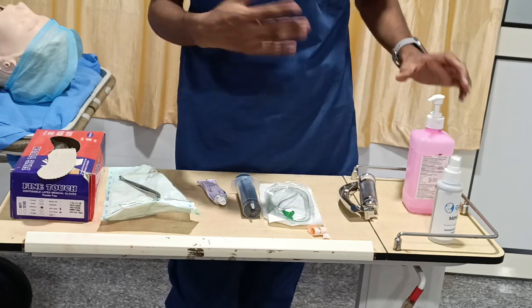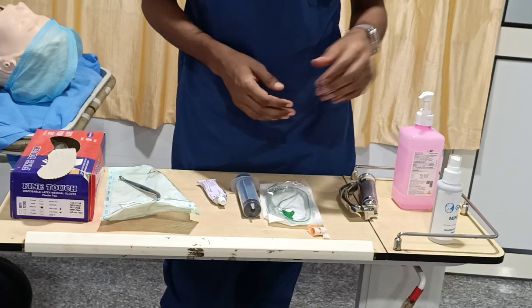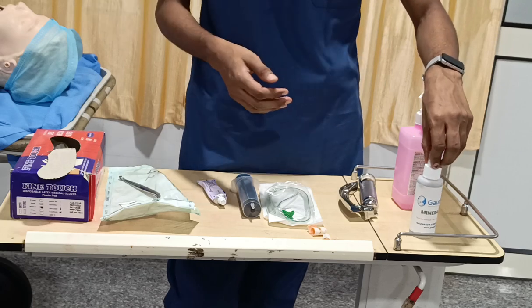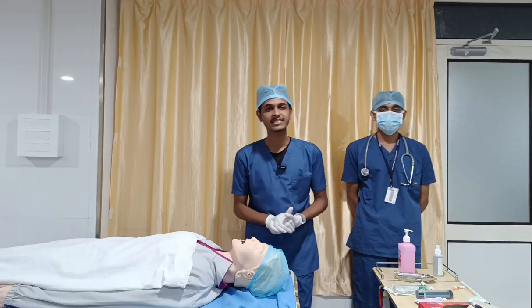So these are the common things. Don't forget to perform your hand hygiene; you have to keep your hand rub also. We are going to perform this on the mannequin. For that mannequin we are using this lubricant. So this is what the equipment is. Now let us get into the procedural part.